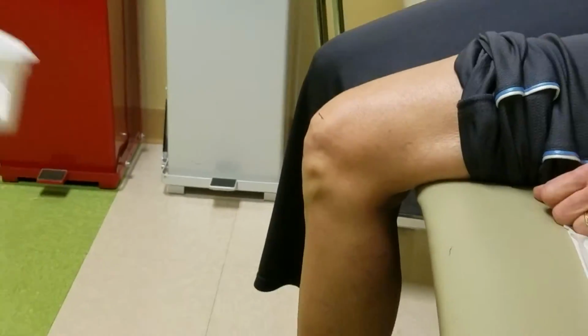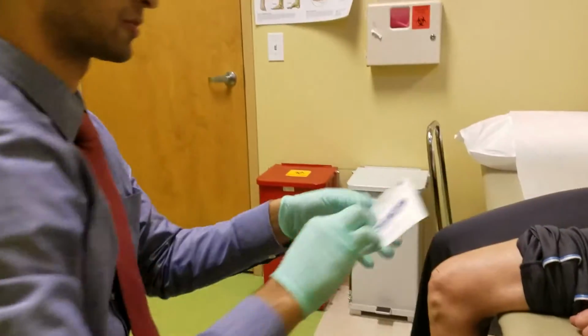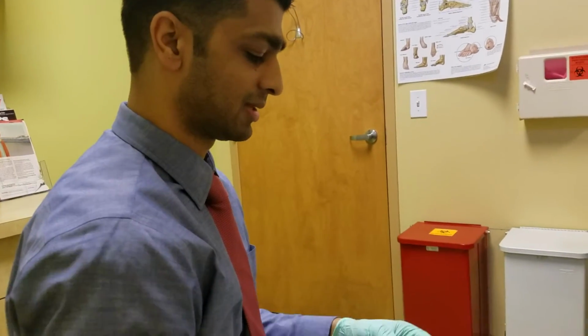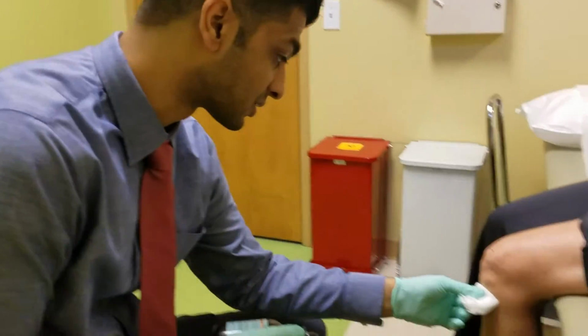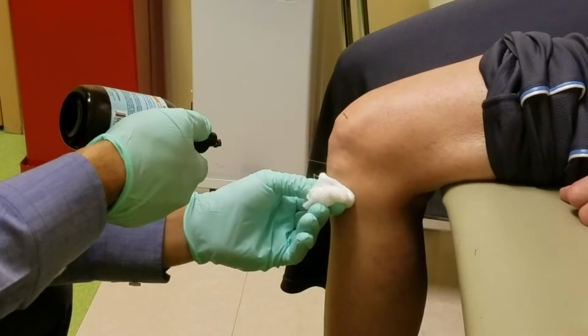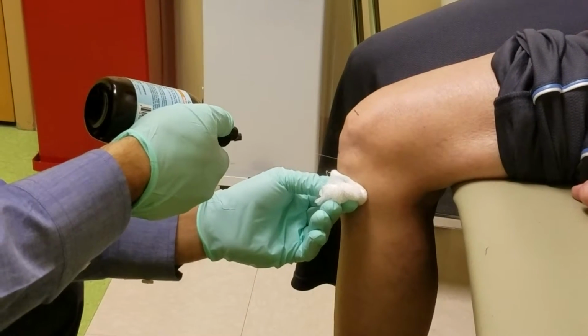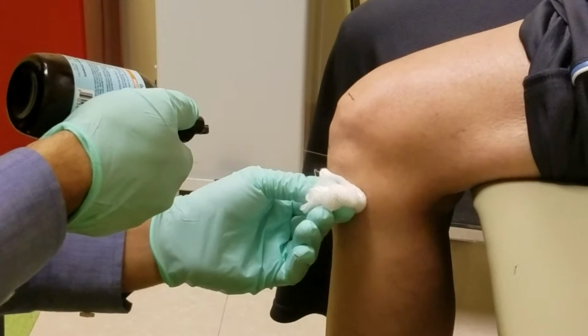Whether you use a topical anesthetic or not is up to the clinician to decide, but I usually like to do that. Most patients do appreciate having that topical anesthetic available. It takes away some of that initial sting. So cold spray here. Usually spray this for about 5 to 6 seconds until you see blanching of that spray on the skin.